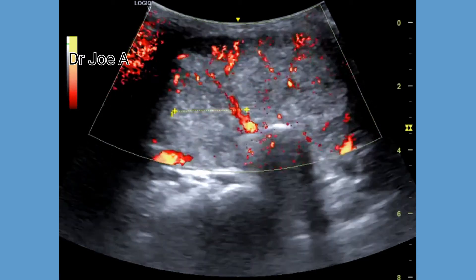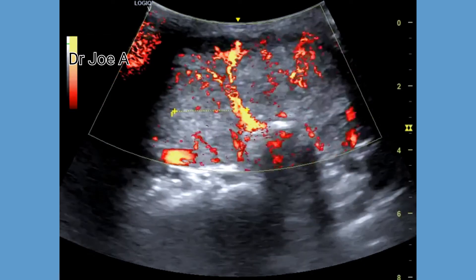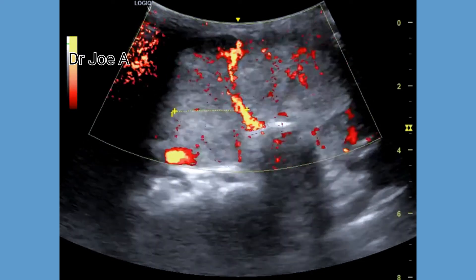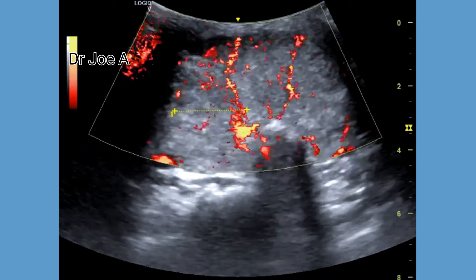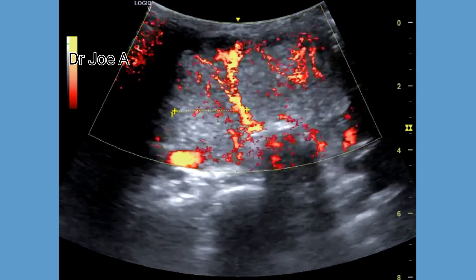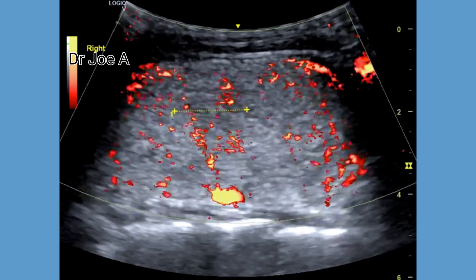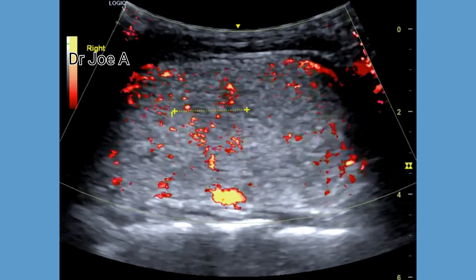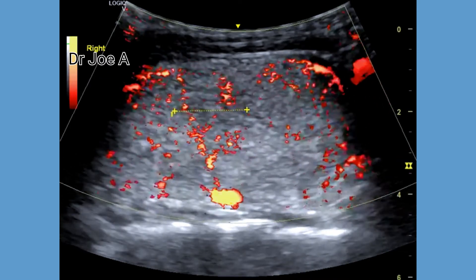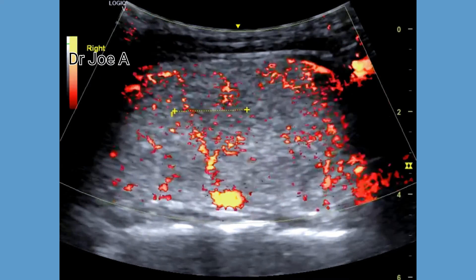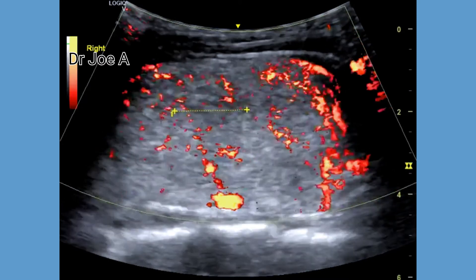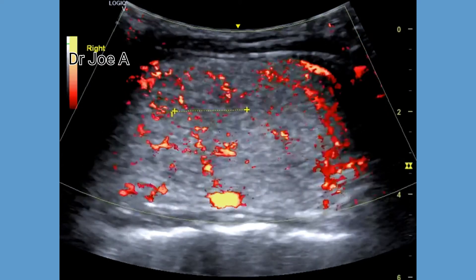Surprisingly, there is no evidence of cystic change of the nodules, and also little or no calcification within the thyroid. All the previously mentioned findings suggest a classic case of a huge multinodular goiter of the thyroid.